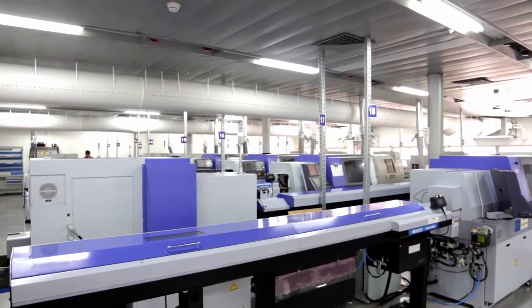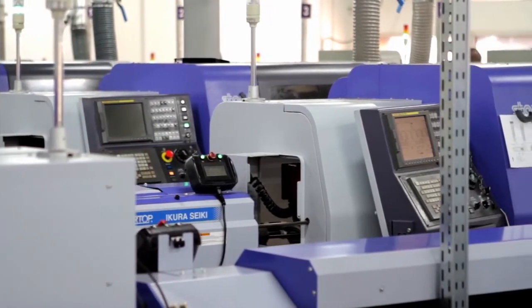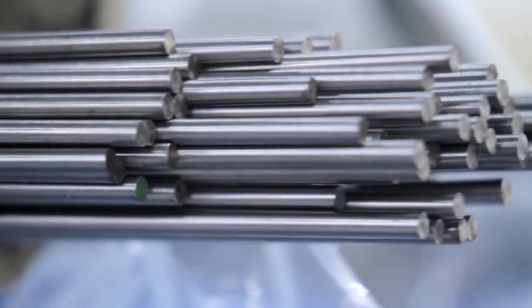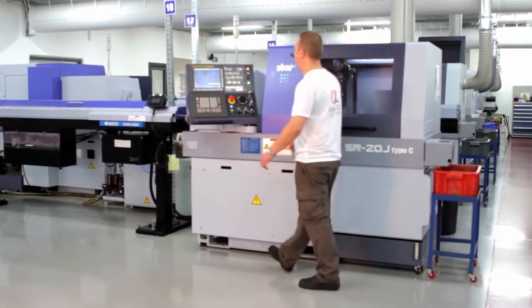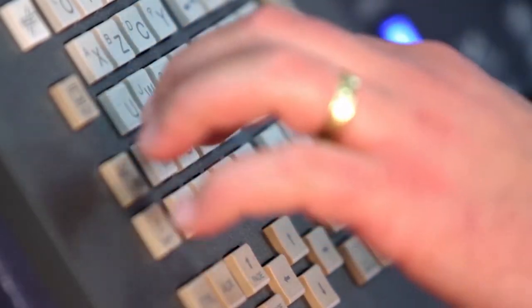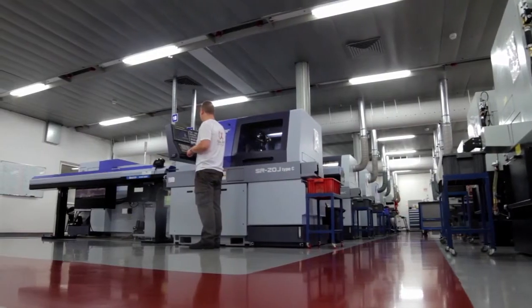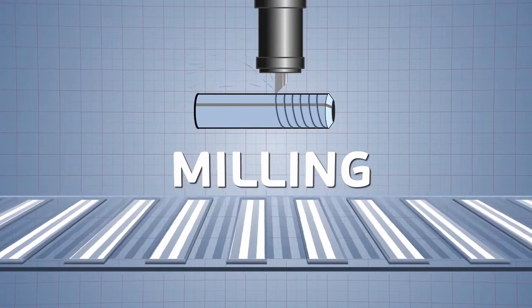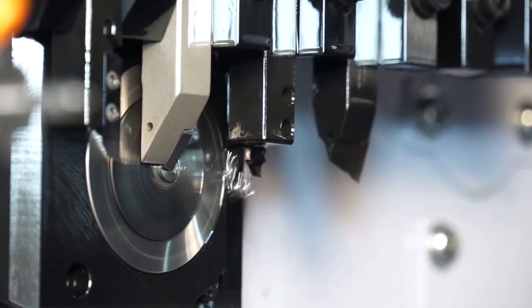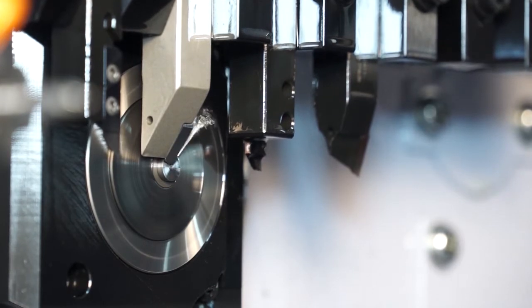Primary products are received as titanium rods and installed on the machine. For dental implant production, high-grade machines like the Swiss type are used. The name comes from the fact that these machines were used in Switzerland to fabricate watch parts. The rod goes through highly accurate processing.